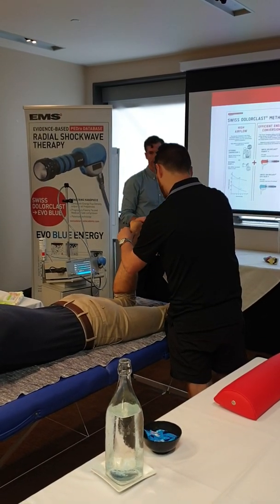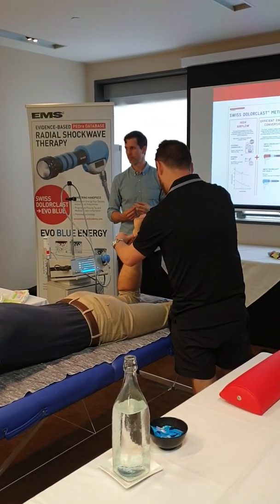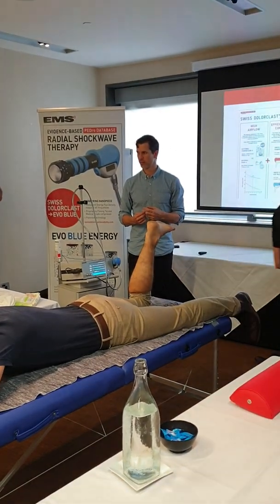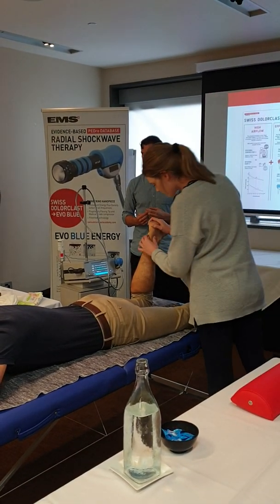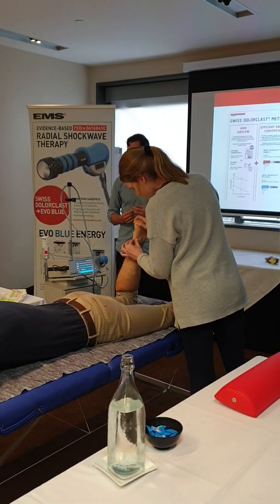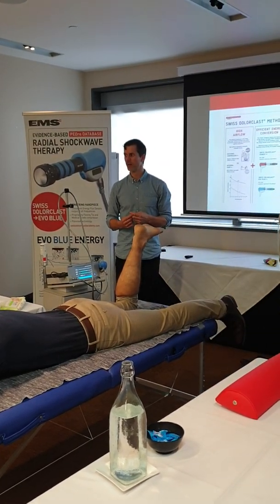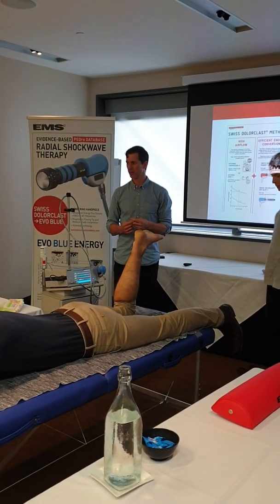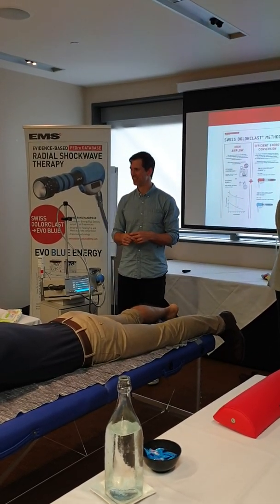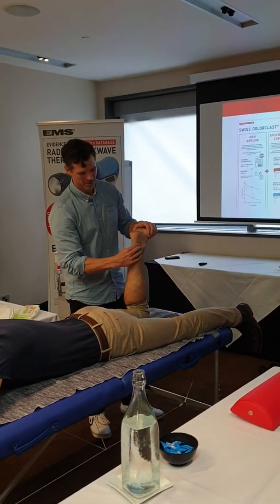It's not super lumpy, is it? But it's dense. So I've treated some that have had lumps in it, and you just ultrasound it from both sides, and it's just half the size. You just can't explain that. It's crazy. It's actually physically dissolving, breaking it down. It's fascinating. The only ones I couldn't get rid of were those that had it for 10 years. But at least if you get it half the size and make it rollable, even if you can still visualize it, it's more functional.